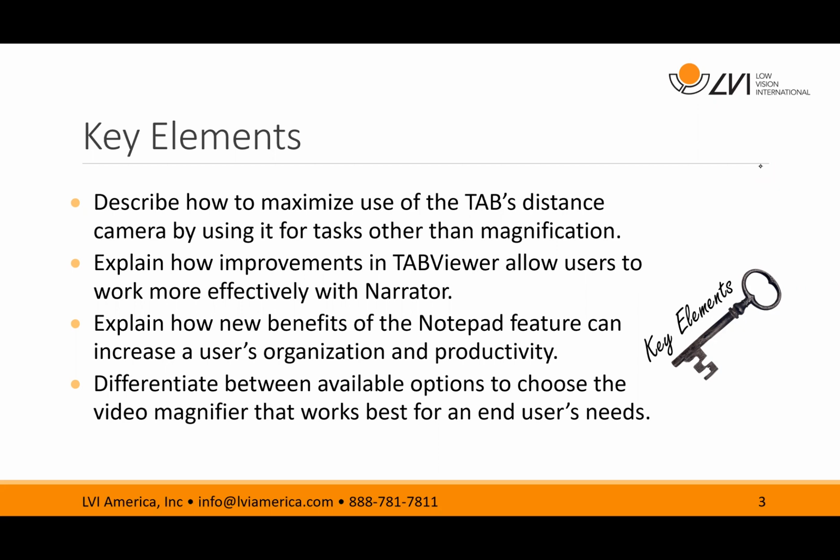We also will talk about basically giving you the available options and for you to be able to choose the best video magnifier that works for an end user's needs. So these are all the key elements that we're going to be talking about today.